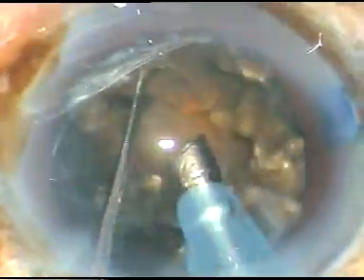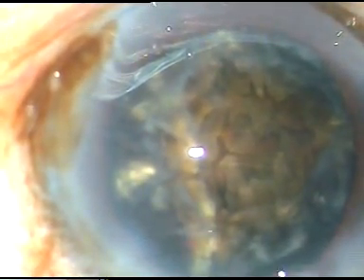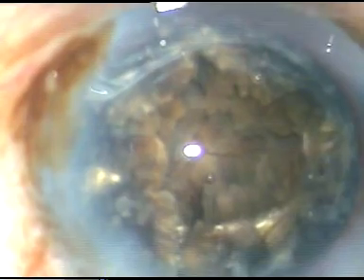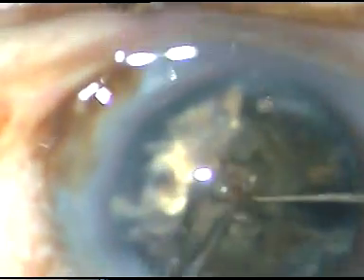At this time my BSS bottle gets over, so I come out and inject viscoelastic substance — this is HPMC again. And now I take two instruments: one chopper and another Sinski hook. Chopper in my left hand and Sinski hook in my right hand. And I am trying to separate the pieces. Yes — I have been able to separate the nuclear fragments. At least two hemi-nuclei have been made.